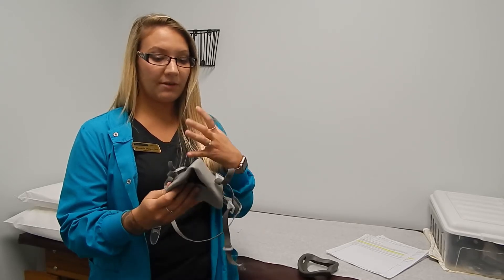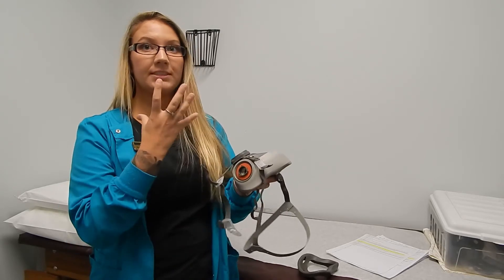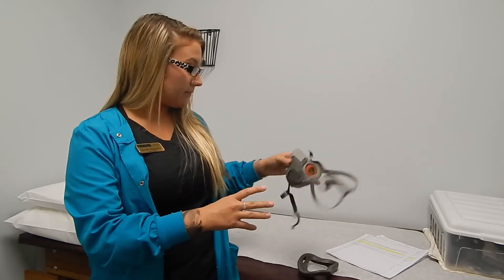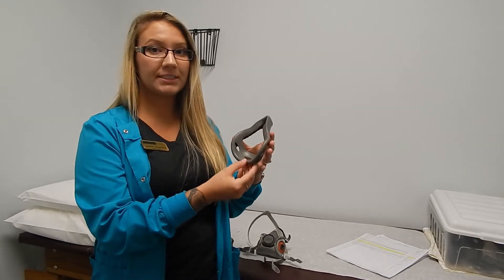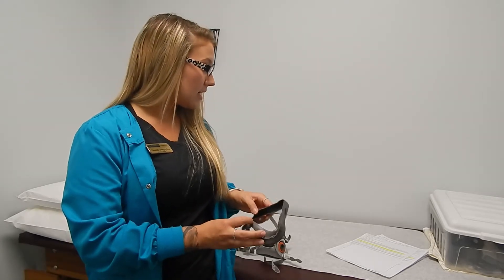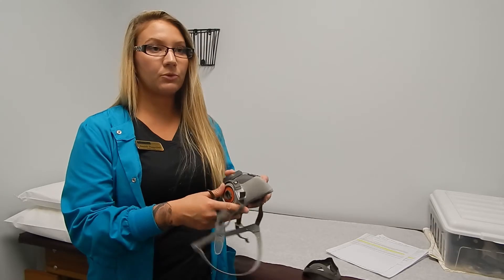When you have the respirator on, we'll do a negative and positive check to make sure you have a good seal while you're working. If there's any facial hair in between this margin at all, we cannot fit test you per OSHA standards, and we follow OSHA here.